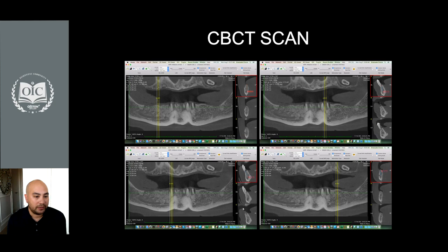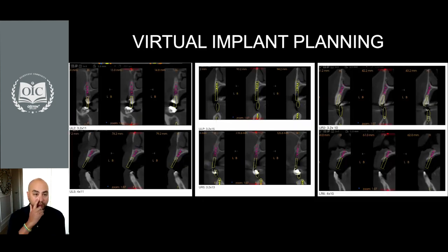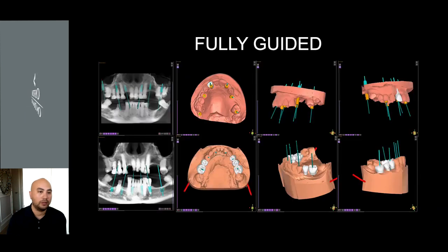Nowadays, it's common practice to acquire a CT scan and plan the case on digital diagnostic imaging software, or we can utilize virtual planning software, like in this case, or more sophisticated ways with the integration of a CT scan with the intraoral scanning data.